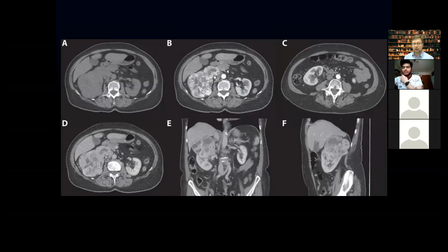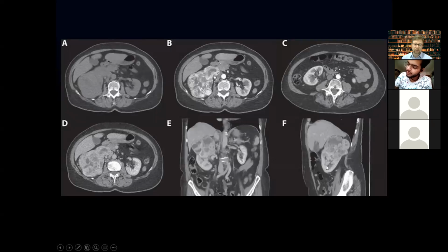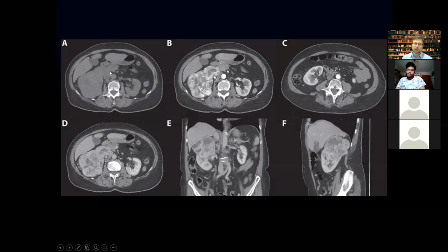So regarding these projections that you saw on the previous slide, we can see 4 axial slices through the patient's body, and coronal and sagittal projections. Very important to achieve 3-dimensional information. This is not only a slice through the patient's body, but different contrasting phases. This is a phase before the contrast. We call it the native phase, before the contrast.